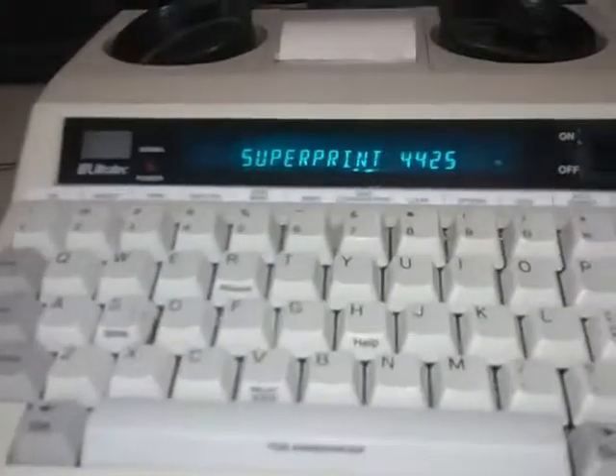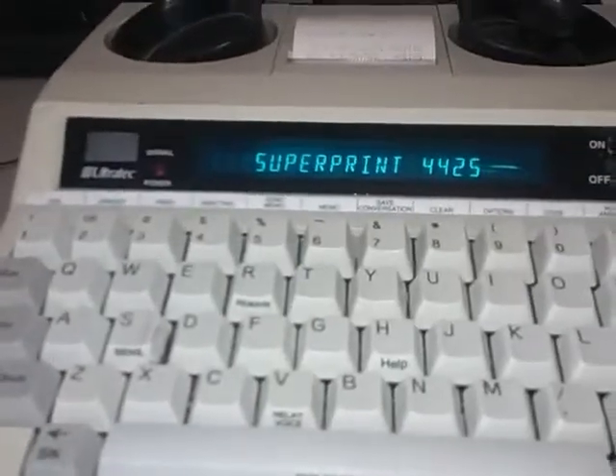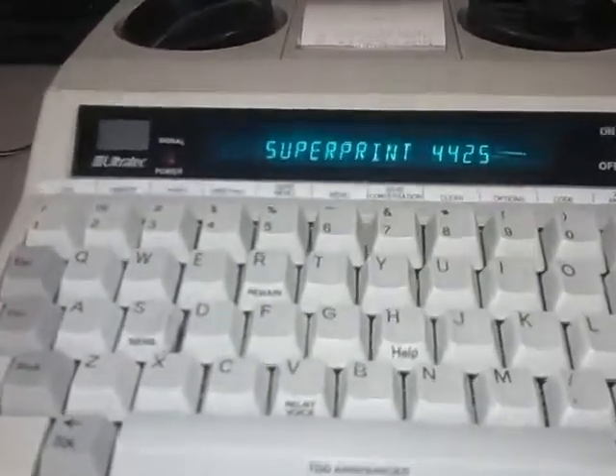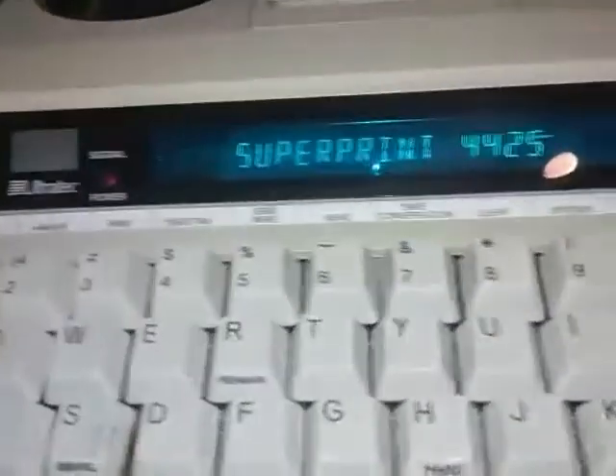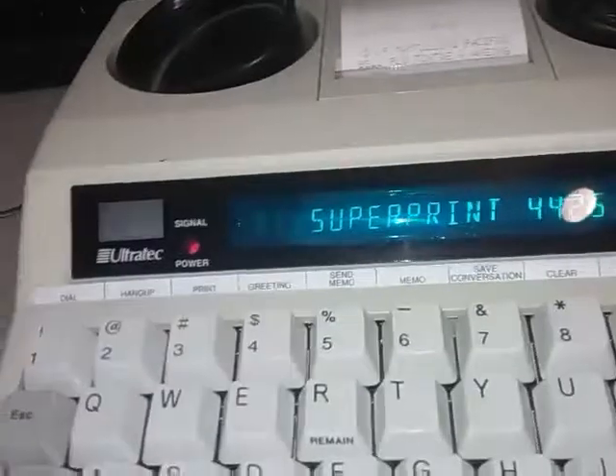We got a TDD device used for deaf people to communicate. You put the headset of the phone there. I'm trying to test it — I don't have any way of connecting to a phone line anymore, it's just smartphones. But I found some tones on YouTube so I can test it by putting the speaker up to the device.